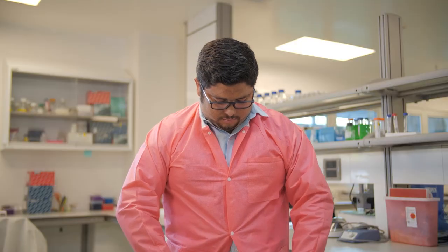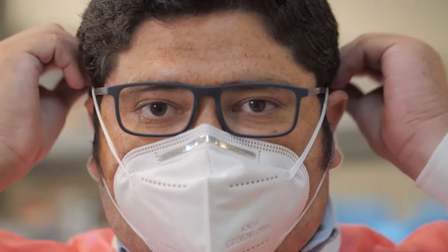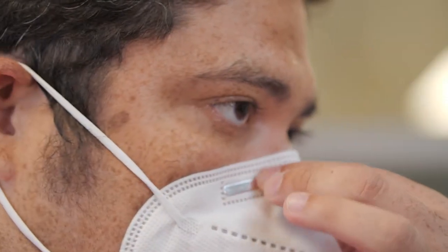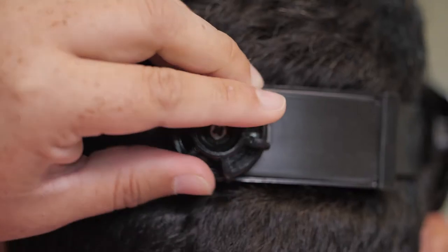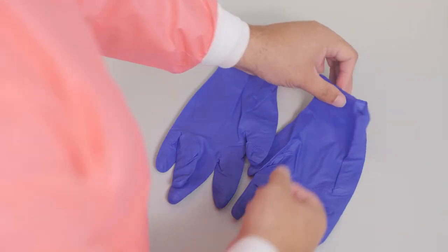We continue with the steps to put on the gown, the mask, the protective face shield, and the gloves.